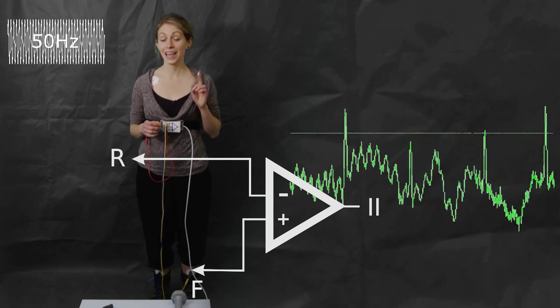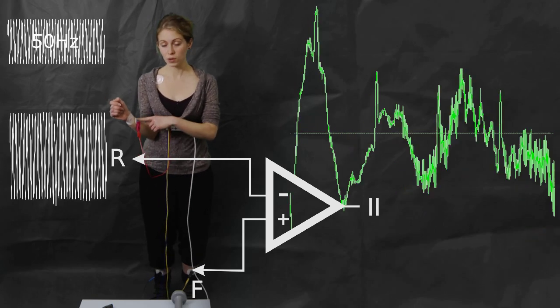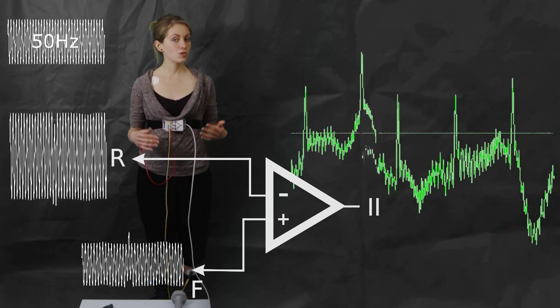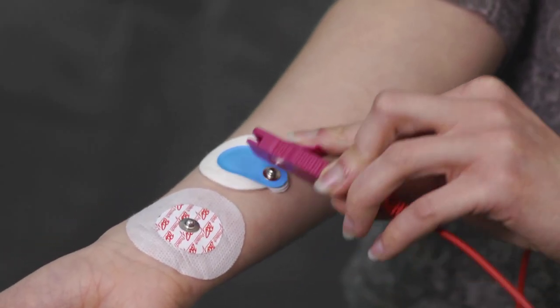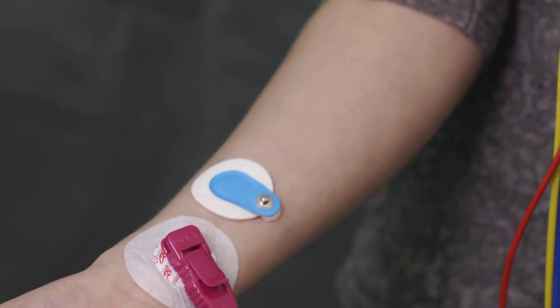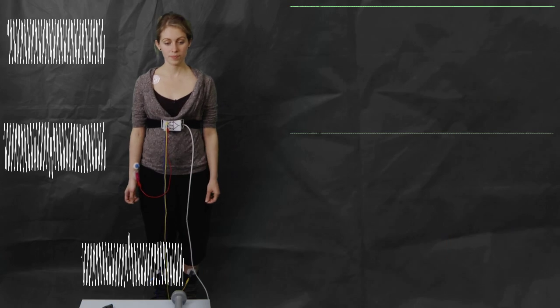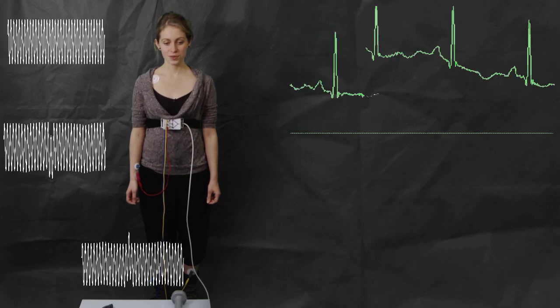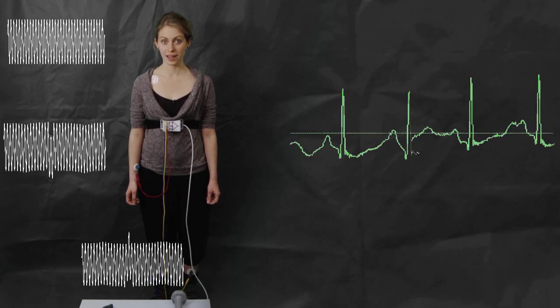noise. However, the noise coming from the old electrode, which has dried out, is slightly different to the one coming from the electrode placed on my foot. So the subtraction will not yield 0. Well, let's switch to the new electrode and see what signal we get from it. So, as we can see, the ECG signal is nice and clear once again.